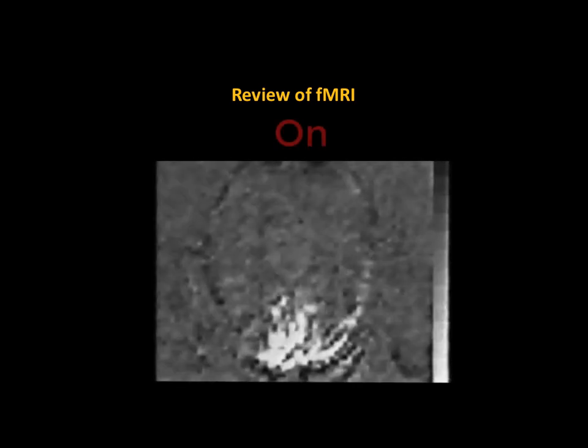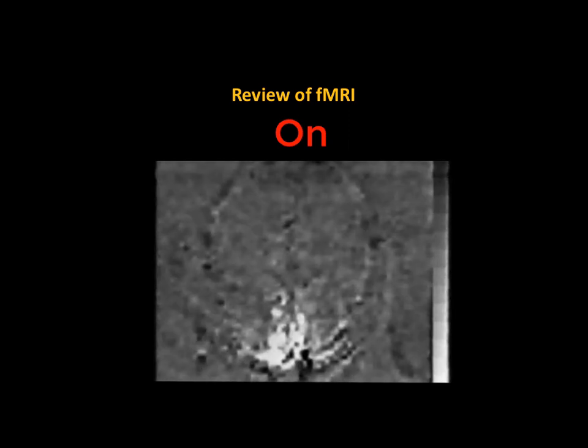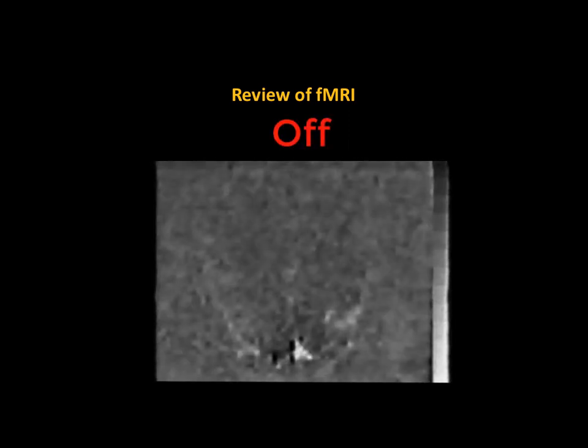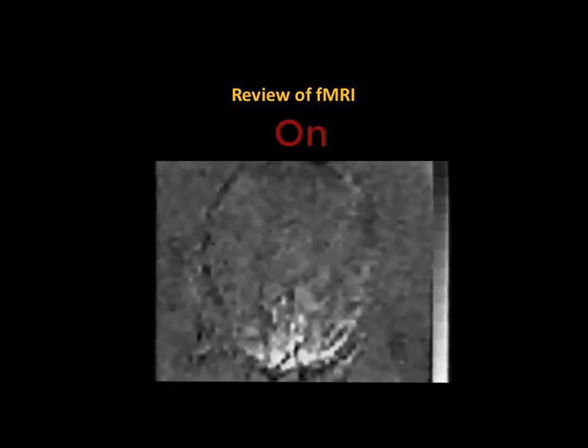This was the first video that they made of it. So there's the front of the brain, this is the back of the brain, visual cortex. Here's what the visual checkerboard's on. Now it's off. And after a little bit, it goes on again.